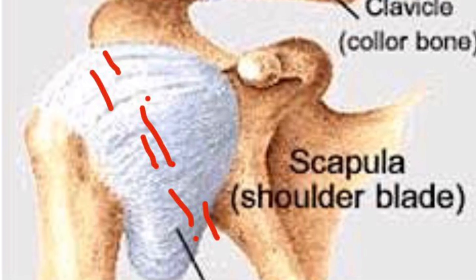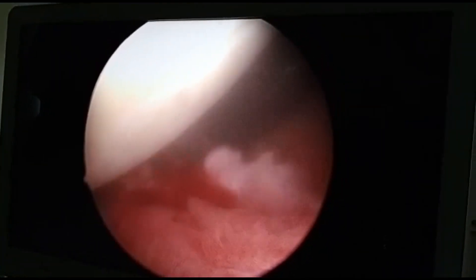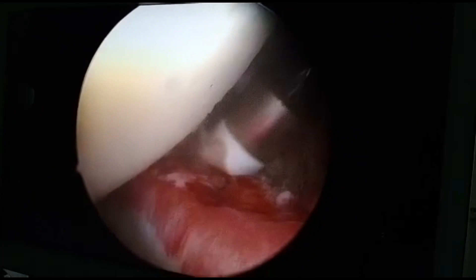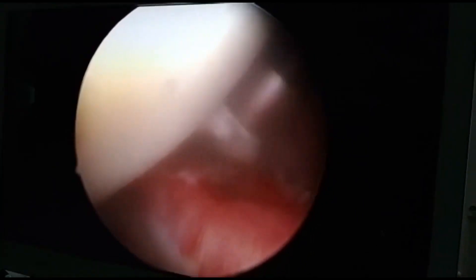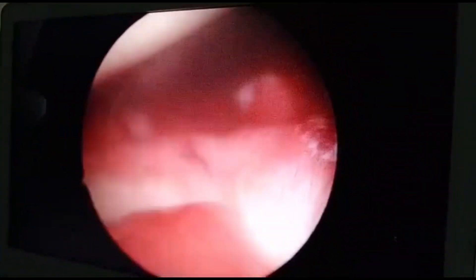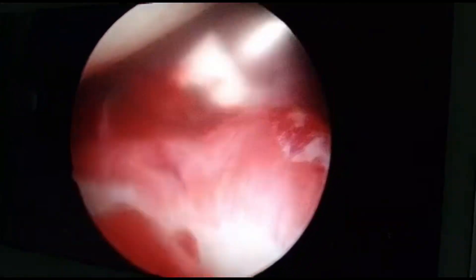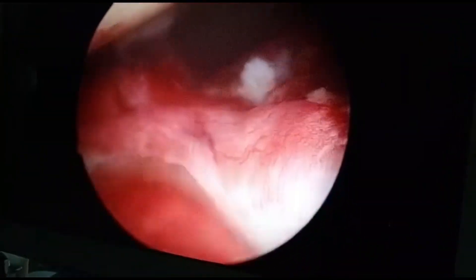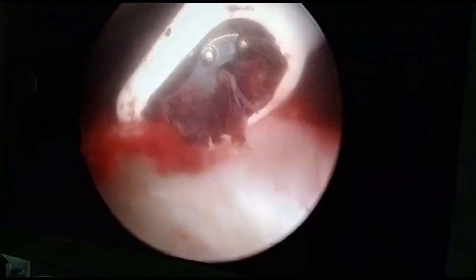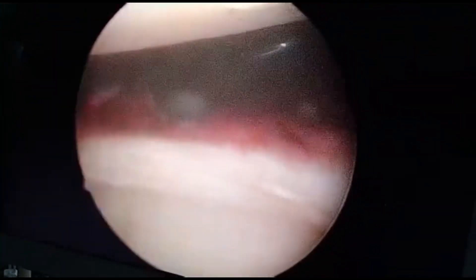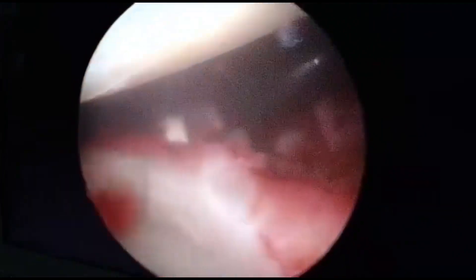This is the anterior capsular release, where the capsule — a tightened structure in the front — is slowly released with the help of an arthroscopic wand. You can see how slowly the wand is used to release the anterior tightness. At the end of the procedure the patient usually achieves full movement.